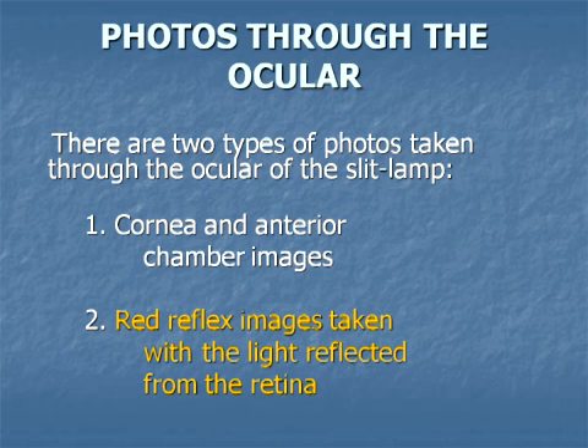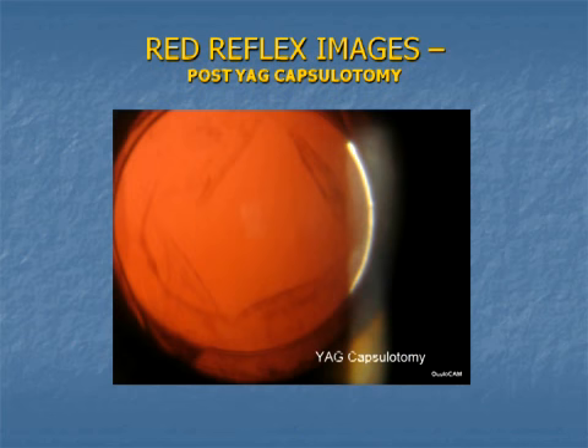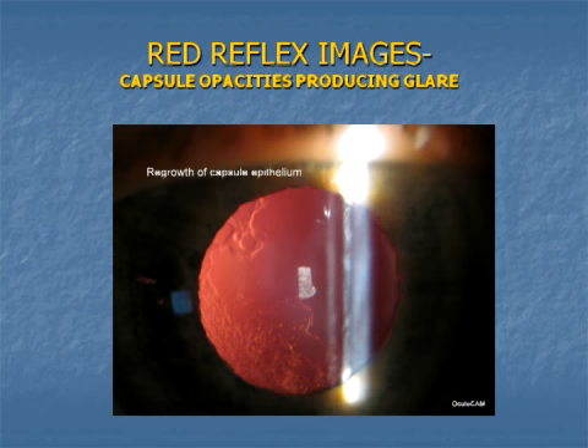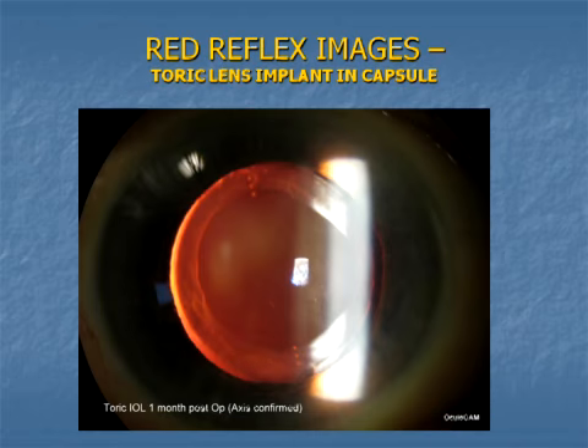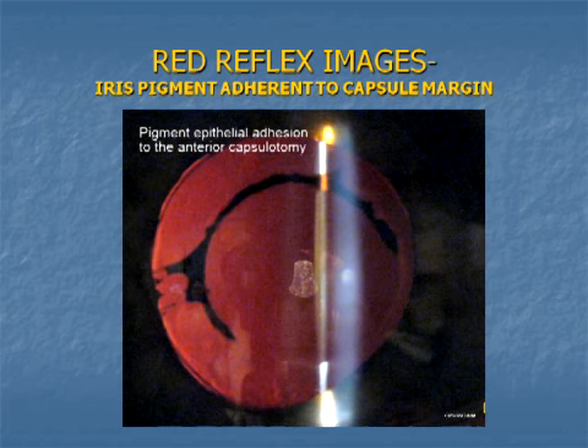Red reflex images are achieved by bouncing the slit beam light off the retina and picking up the image in the reflected beam. Capsule opacity shows up well with this method. A photo of capsule clouding will support the need for treatment when the patient has disabling glare symptoms even though acuity is still good. The position of a toric lens can be confirmed accurately with post-op red reflex photos, provided the pupil dilates well enough to see the index marks. Corneal or lens precipitates often show best in the red reflex. For some reason, the pigment epithelium of the iris adhered to this routine circular anterior capsule opening.